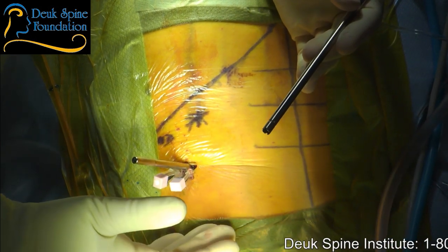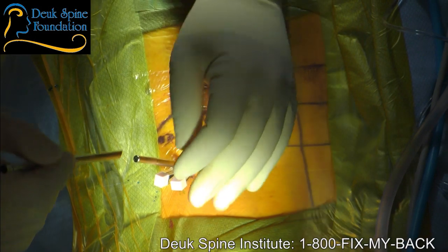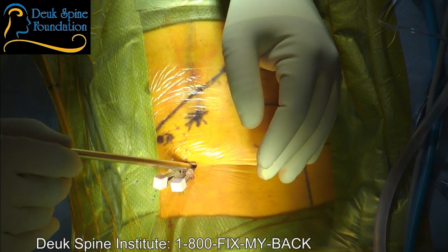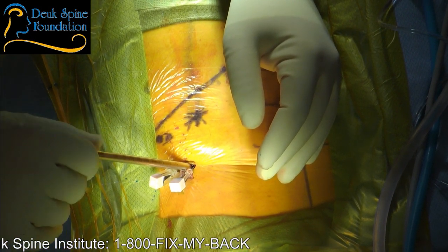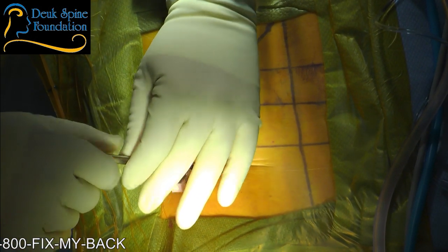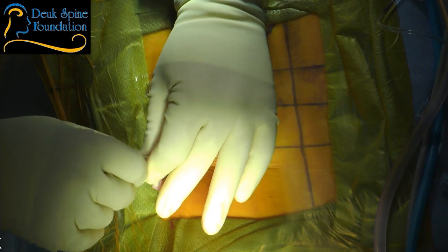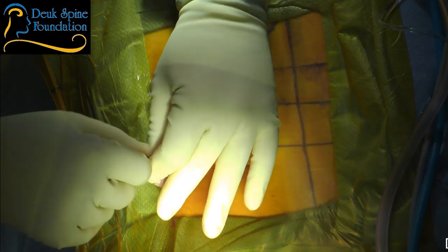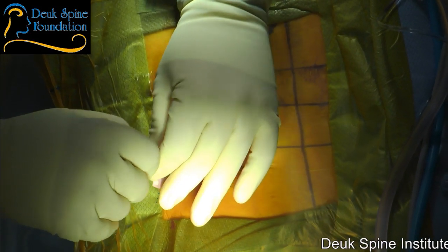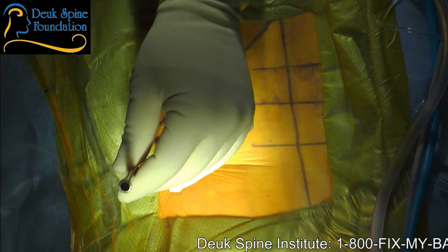So for degenerative spinal condition, the endoscopic disc repair that I'm doing will replace 95% of spinal fusions, artificial discs, laminectomies, microdiscectomies. All those surgeries are done, and they're not as good as this procedure because they require big incision, removing bone from the spine. We're not going to take any of this patient's natural bone out, so we're not going to destabilize his spine at all. By doing open surgery, the surgeon has to remove bone and ligaments that are normally there to stabilize the spine. So they're going to make the spine more unstable, which is why we have to do fusions often, because you don't want to leave a patient with an unstable spine. They're going to come back again in a short time and have a fusion done. So you just do it all at the same time.